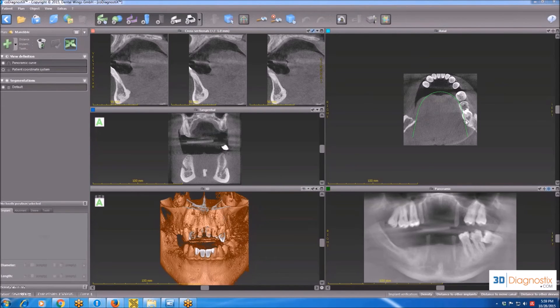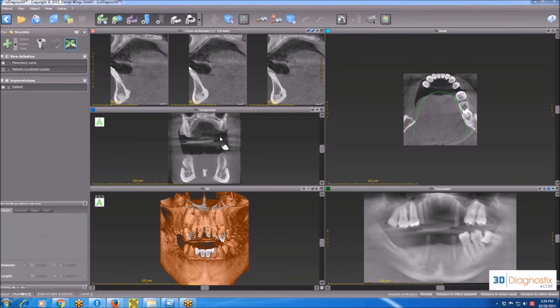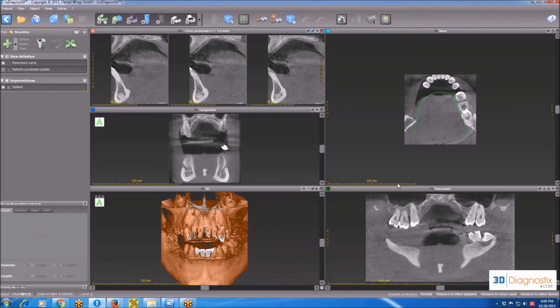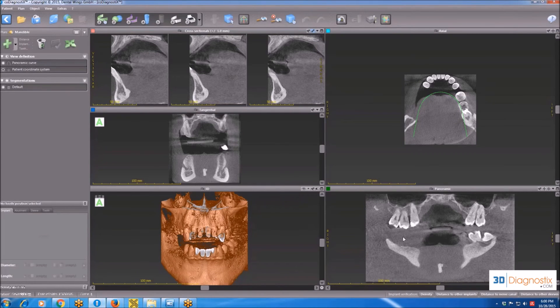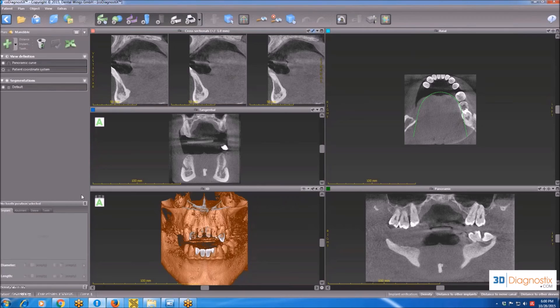As you can see over here, we have five main views: the cross-sectional, the tangential, the 3D, the panoramic, and the axial view. You can see over here we have five views, a top tab, and this panel on the left.